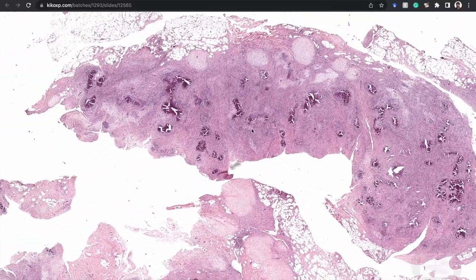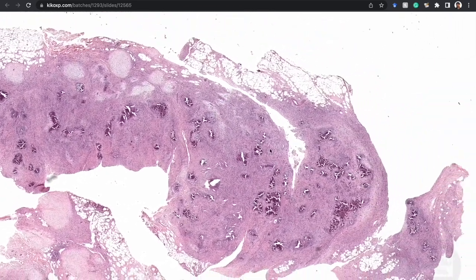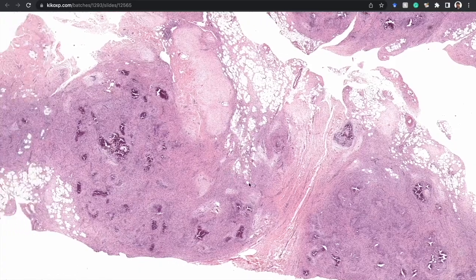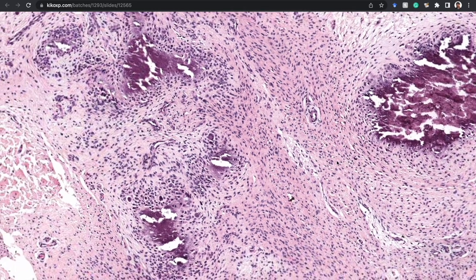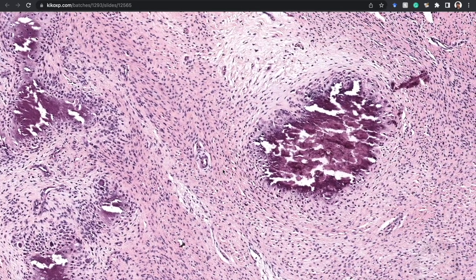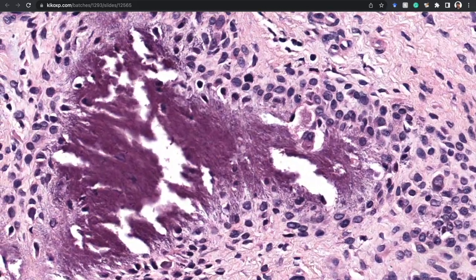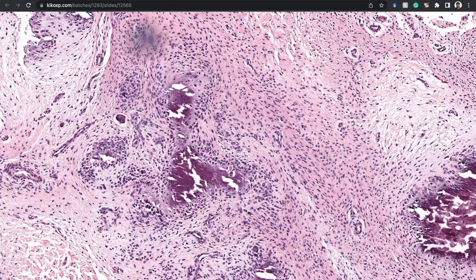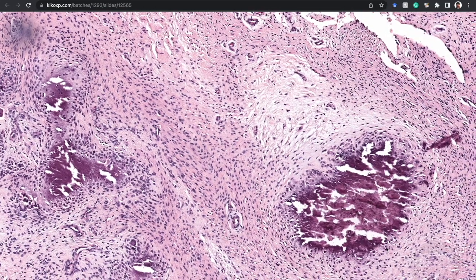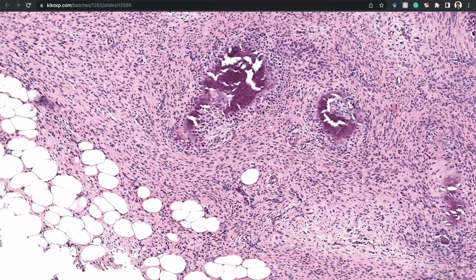Let's do one more here. This is probably a palmar mass in a child — that would be the classic story — and it's down deep, usually in either the subcutis or even deeper down to the tendon sheath. You can see that really all of it looks kind of the same: we've got islands of fragmented calcifications, and these are surrounded by kind of uniform round cells. The round cells wrap around these islands of calcium, and in some places they kind of come out like spokes on a wheel.